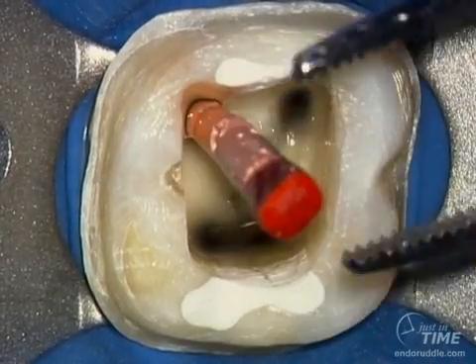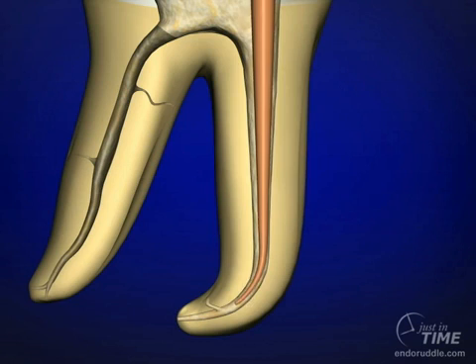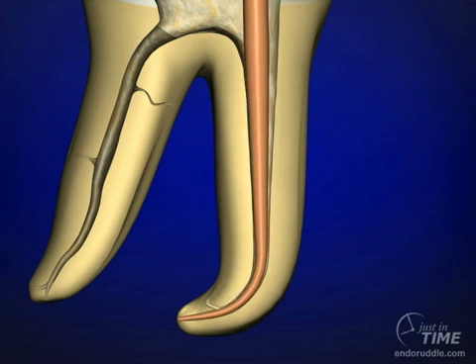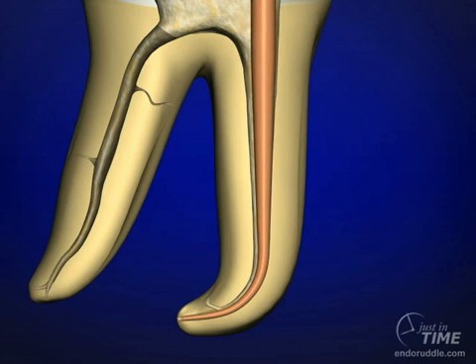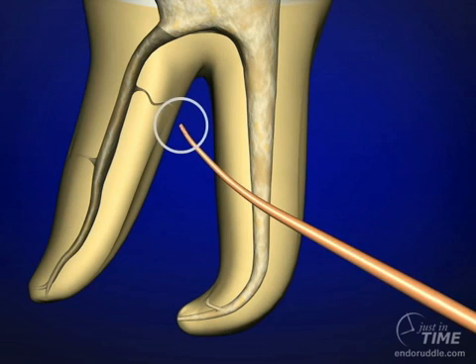I typically have sodium hypochlorite in at this time. I'm checking the cone for short, crisp tugback. When I remove the cone, I can further look at the cone to evaluate where the scratches, striations, or rub marks are.